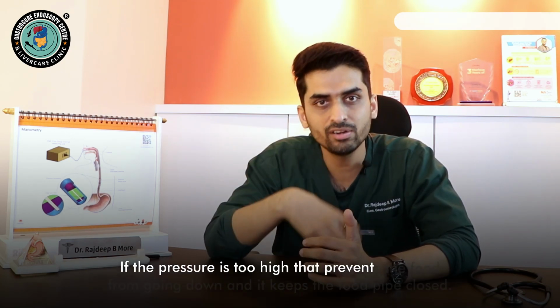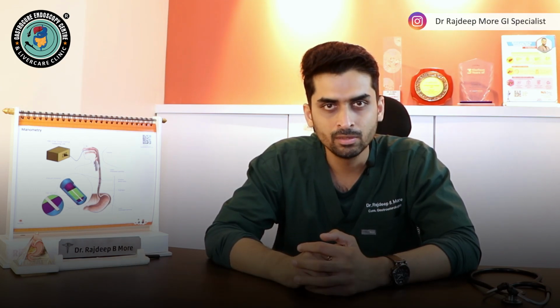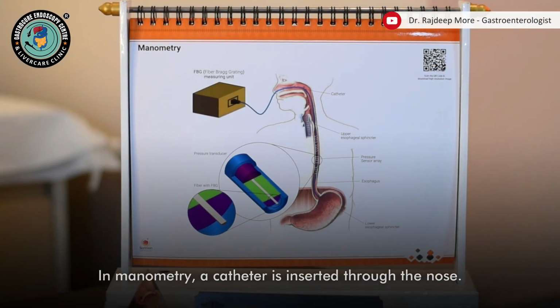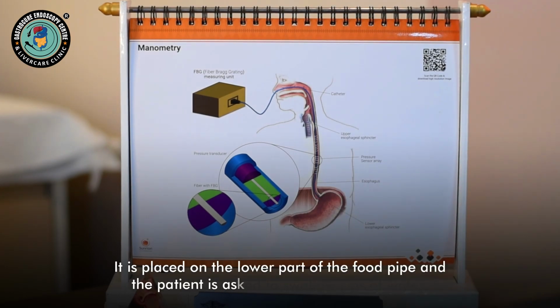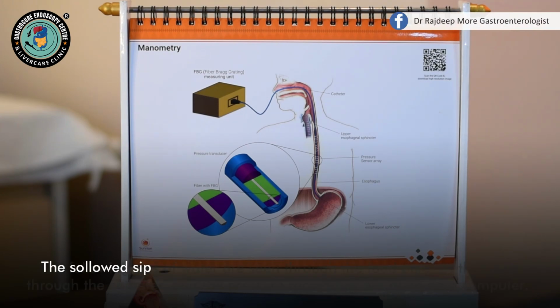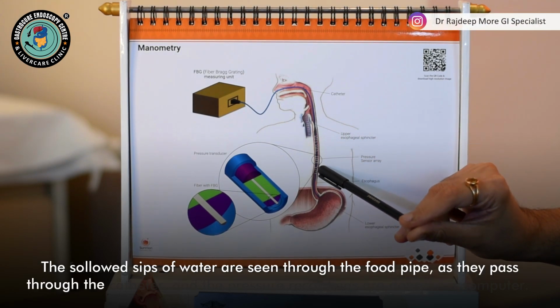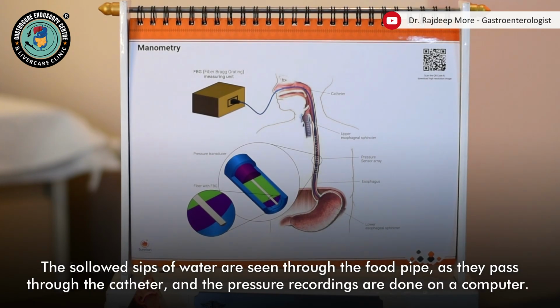The pressures may be too high, which prevent the food bolus from going down and keep the food pipe closed. So in a manometry, a catheter is inserted through the nose. After applying local anesthetic, it is placed in the lower part of the food pipe and the patient is asked to swallow sips of water. When the swallowed sips of water pass through the food pipe, the pressure recordings are done on a computer.